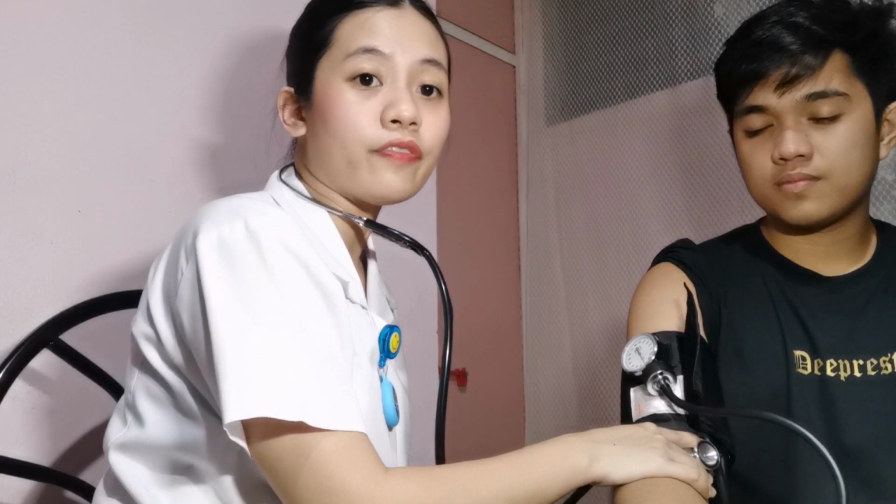Pump the cuff quickly while watching the gauge to at least 30 points higher than the point at which you no longer hear or feel the pulse. Inflation of the cuff compresses and closes off the brachial artery. Deflate the cuff at a constant rate of 2 millimeters of mercury per second by unscrewing the valve on the bulb counterclockwise to prevent inaccurate reading.